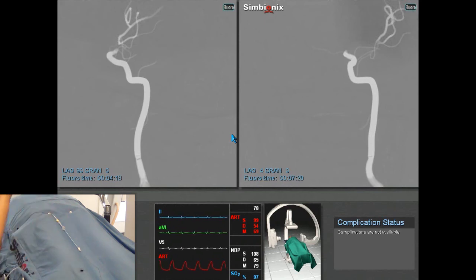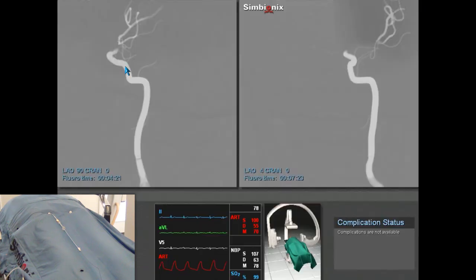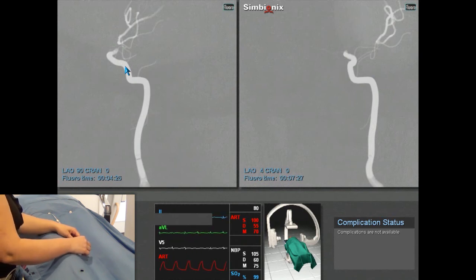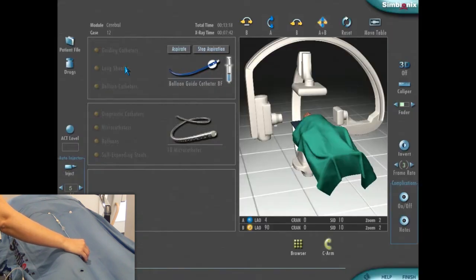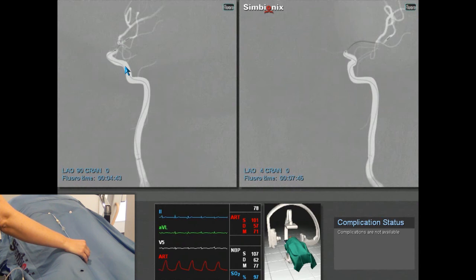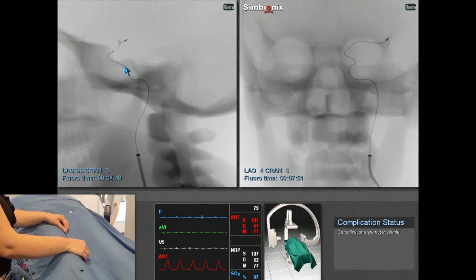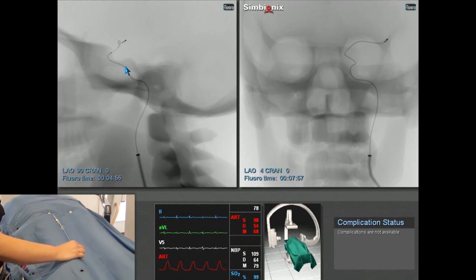And now inject a little bit of contrast material to document that the vessels are there beyond the occlusion. So once you have your catheter in place, now you can select a mechanical thrombectomy device. So you place that out just beyond the distal marker, and then while fixing that, essentially unsheath the Solitaire stent retriever. These are typically made of nitinol, and you'll be able to see it faintly, at least under fluoro, in the middle cerebral segment to the supraclinoid segment of the left carotid.